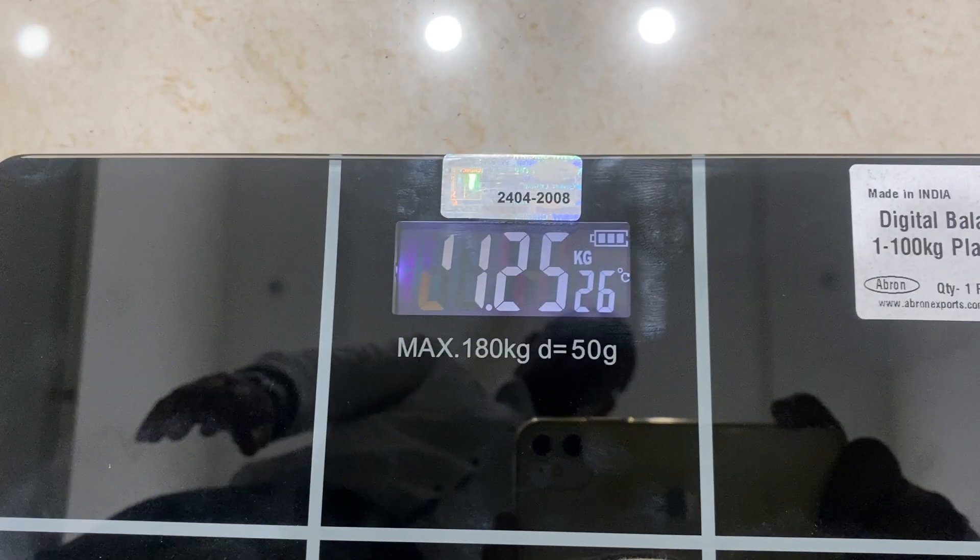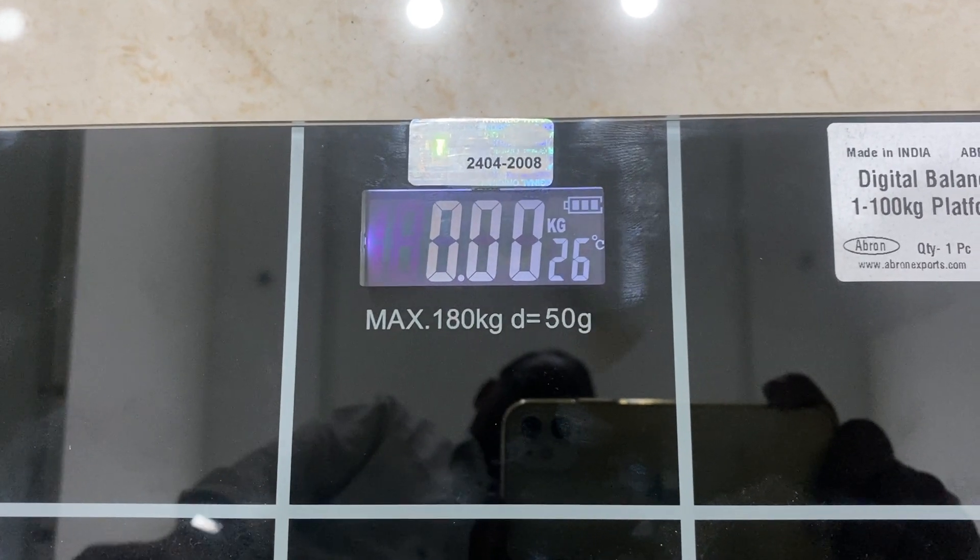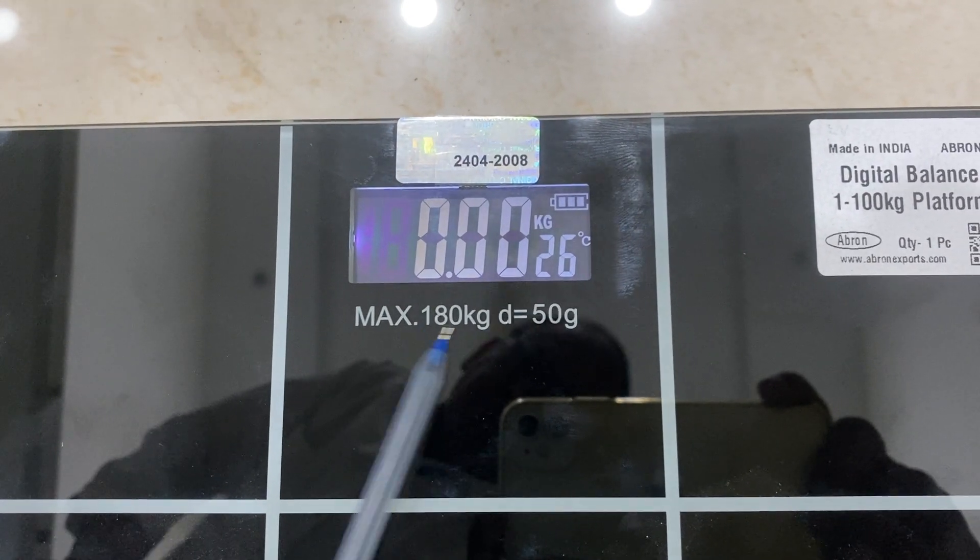Again, this starts from 7 kg minimum to 150 kg or 180 kg. There is another model with us which is up to 150 kg.